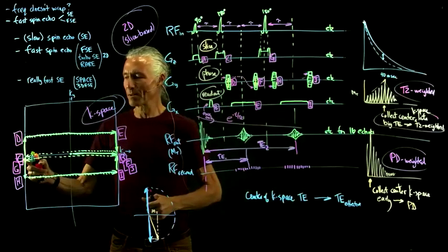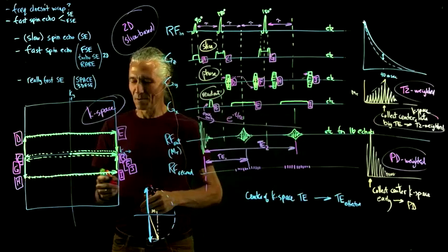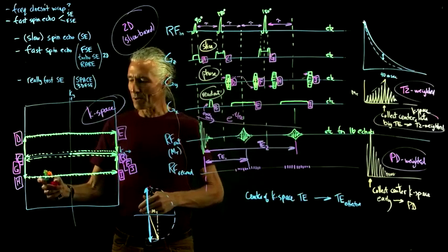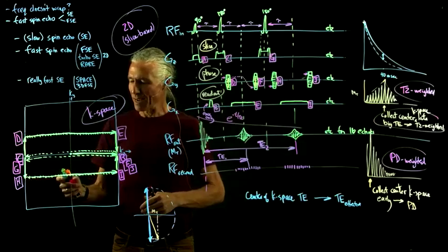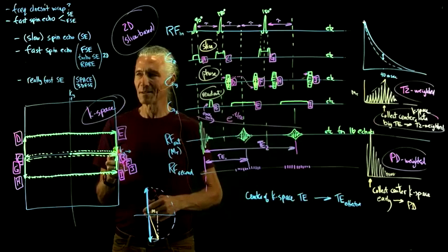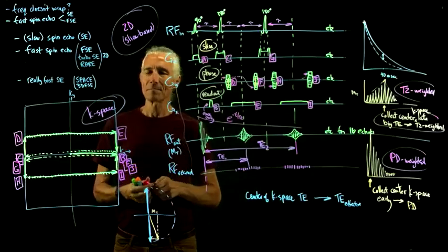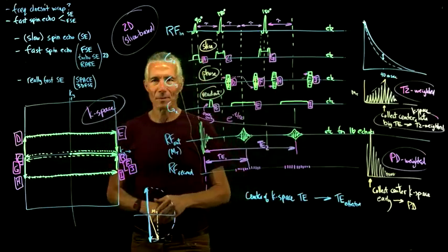puts us over here, go to some other place in k-space, different stripes, and then unwind and then rewind the vertical stripes, collect a bunch of data, and then fix that, so you can just sort of keep going like 16 times. So that was fast spin echo.